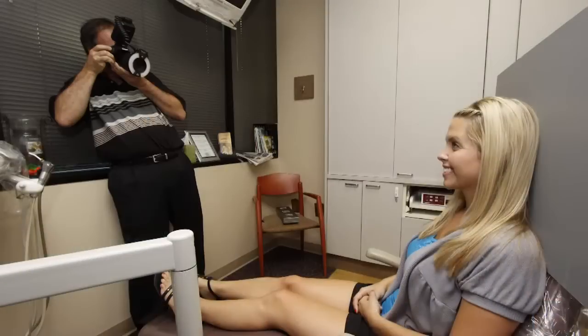What you want to avoid — and you've seen pictures taken in the dental chair — they're just not attractive. It's very simple. This is just gray foam board that I got, I think it's from Staples, very inexpensive. Just slide it right behind the head of the patient. It looks great. Another technique would be to get a monochromatic towel of some sort — just make sure it's a more neutral gray. You can have the patient sit sideways on the dental chair, have someone drape the cloth behind them, and that's even better.